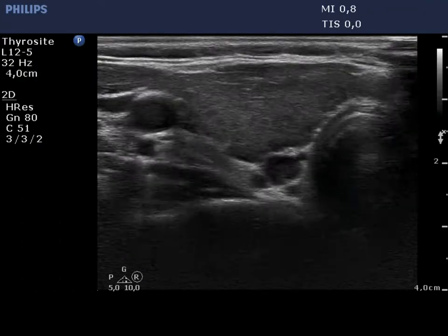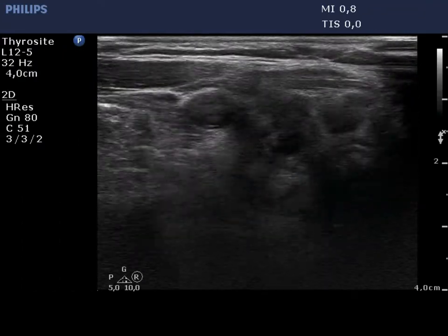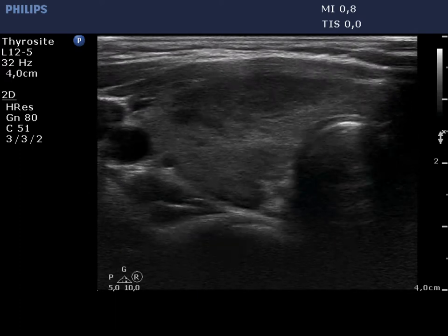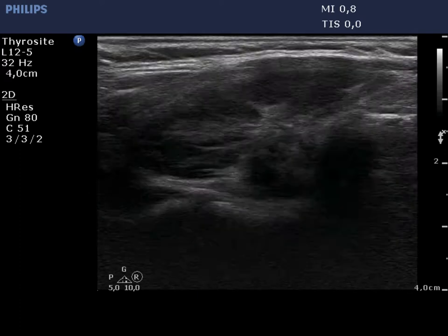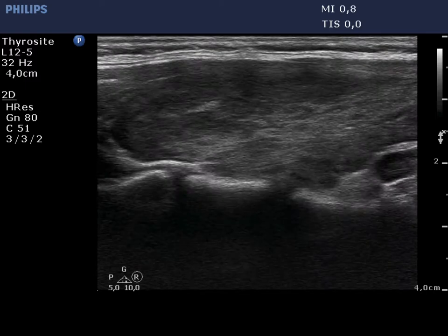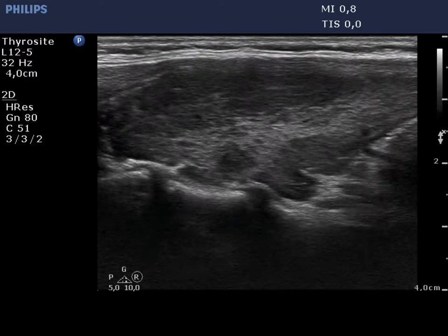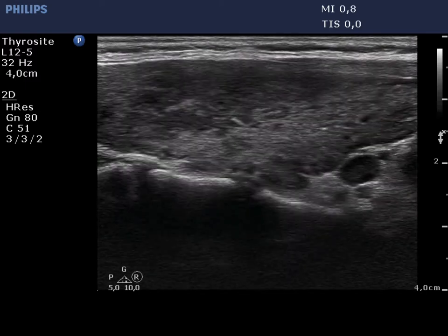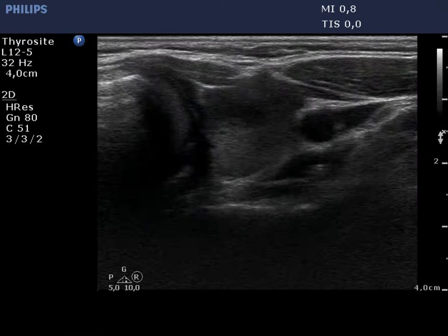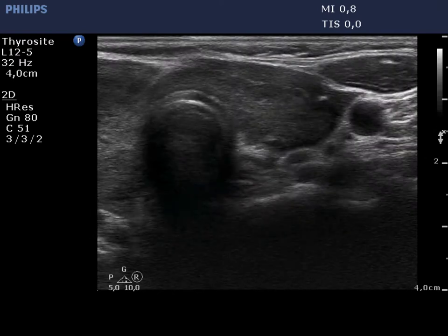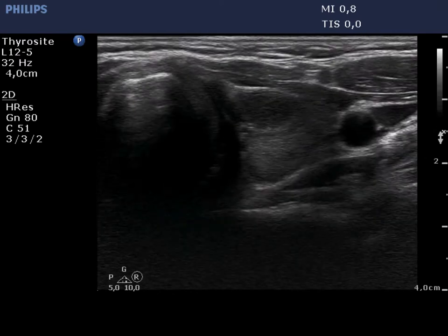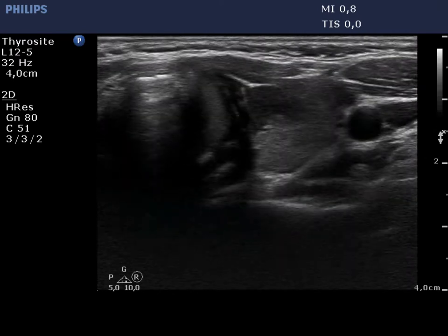The right lobe is composed of hypoechoic and echonormal fields which are clearly not pathological nodules. The borders of the discrete hypoechoic areas are partly blurred, partly puzzle-like. The left lobe has a similar presentation.